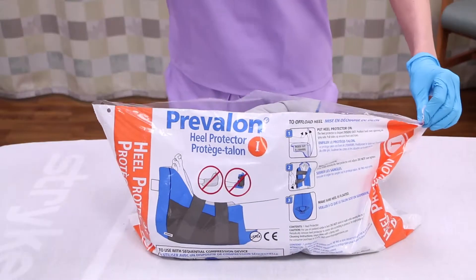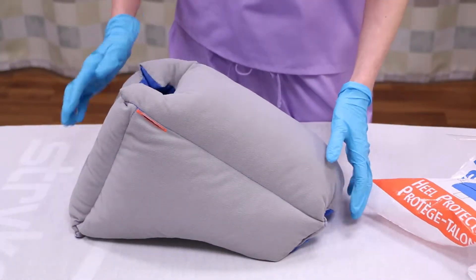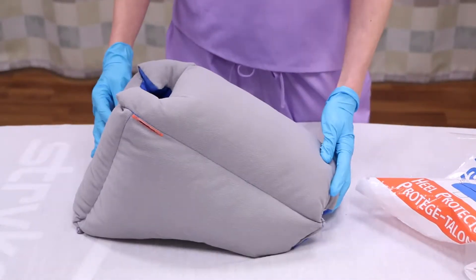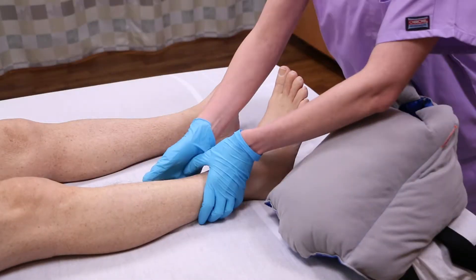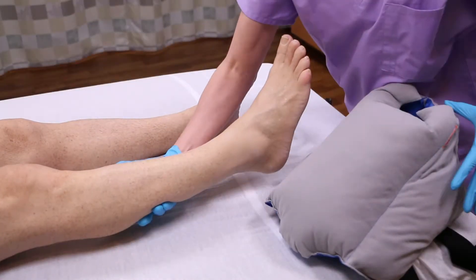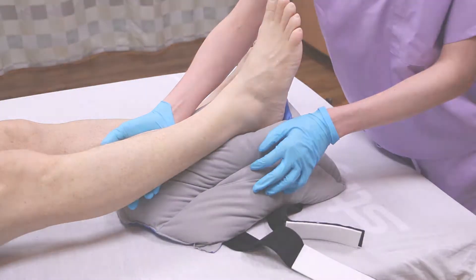To begin, open the bag. The Heel Protector is packaged inside out to make it easy to properly position the heel. Place the Heel Protector on the bed with the long side next to your patient's leg. Position the heel over the opening. This is essential to float or offload the heel.